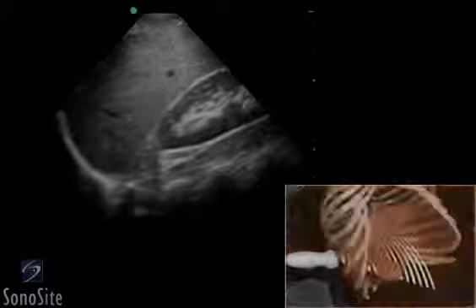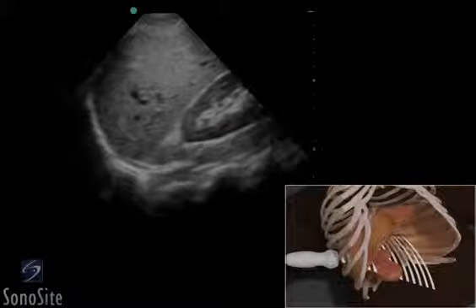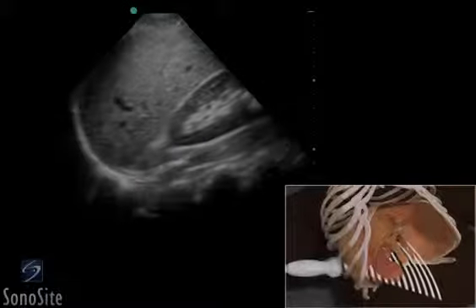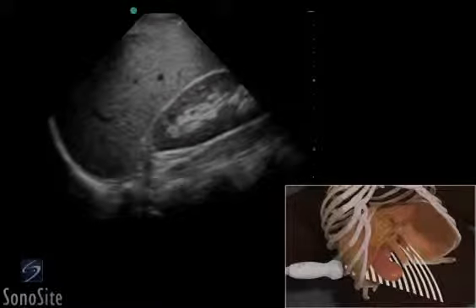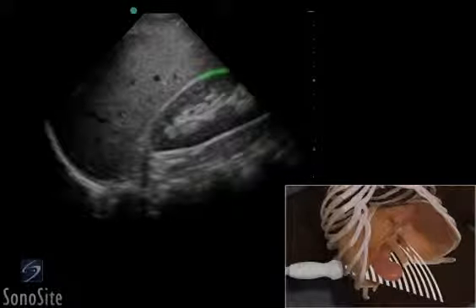Sliding the transducer upward will visualize the diaphragm and pleural interface. Sliding the transducer downward will visualize the inferior pole of the right kidney.